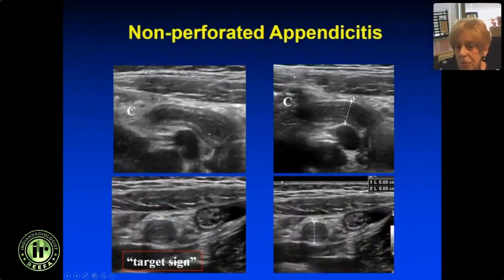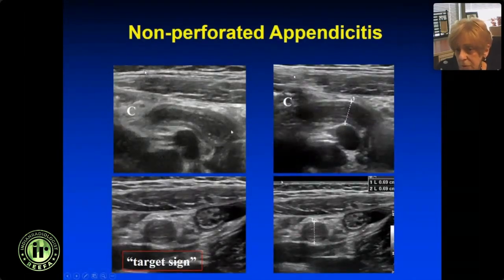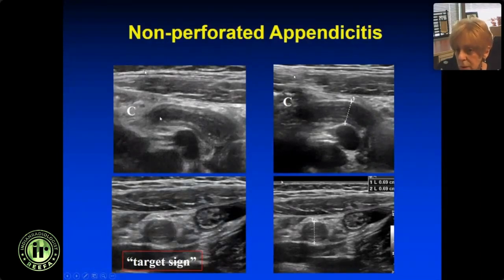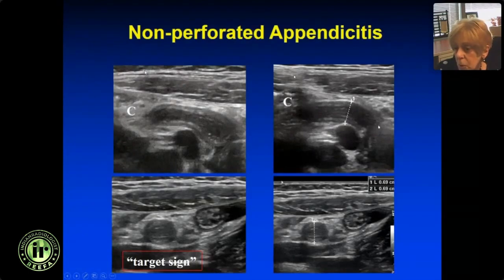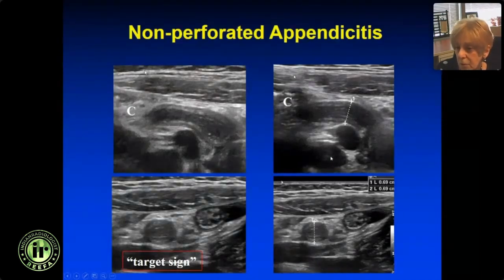Here's the cecum and here is the appendix — it's dilated, it has a blind end, there's echogenic mucosa and submucosa, and fluid in the lumen. We have the target sign on cross-section. This is really the image you want to make the diagnosis. You make measurements where the appendix is largest; I like doing it on the long view but you can do it on the short view or both. This one was 7 millimeters — that's appendicitis.